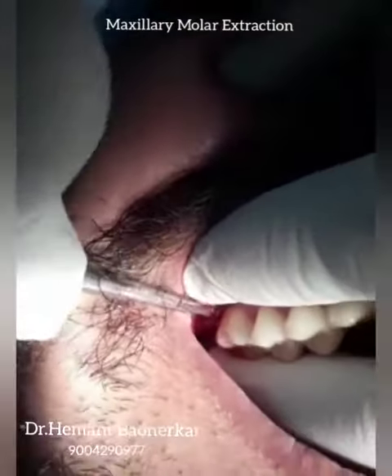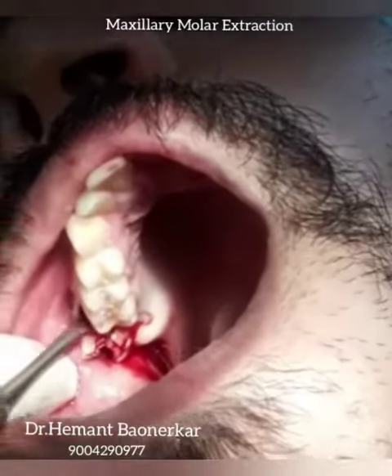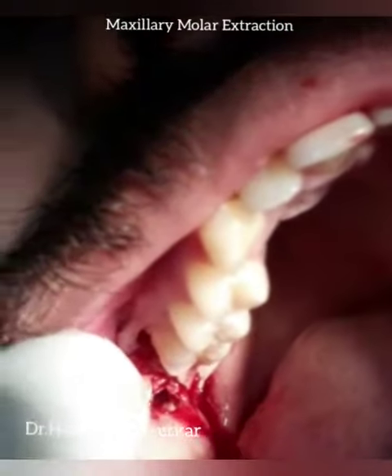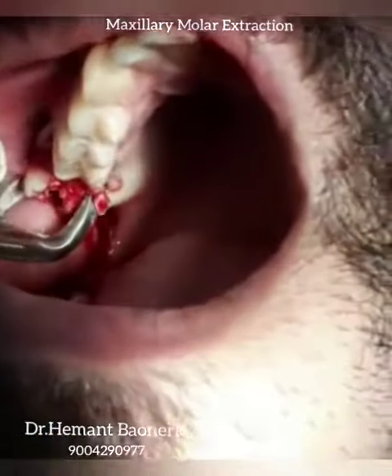Notice how I am holding the tooth with my opposite hand — one finger is in the buccal vestibule and one is in the palatal. After elevation, the tooth is now luxated. I can now use a maxillary molar forcep or third molar forcep to hold and extract the tooth.